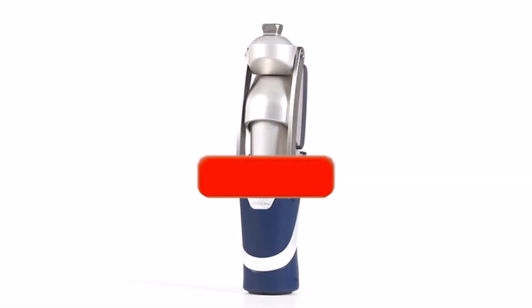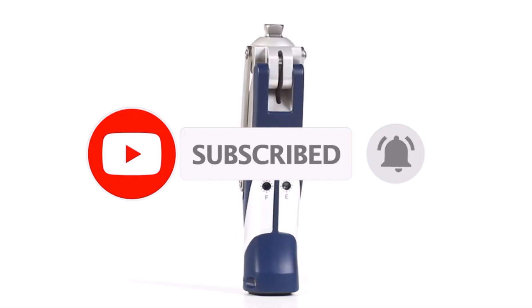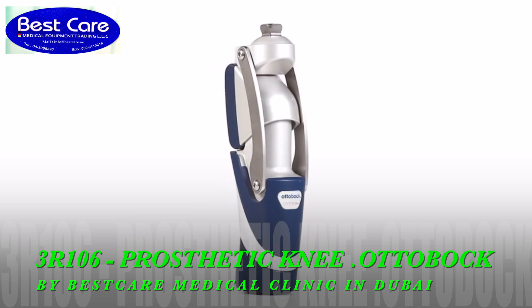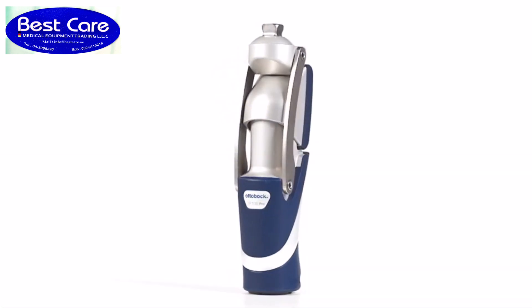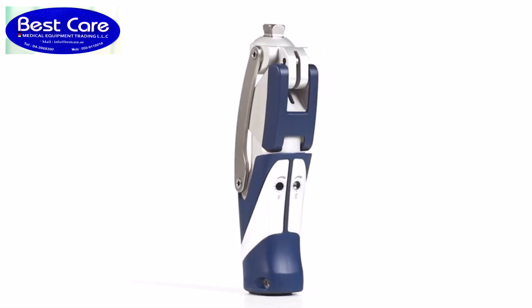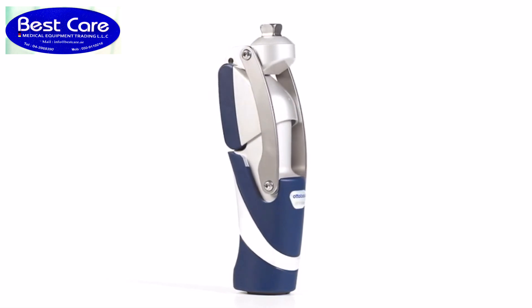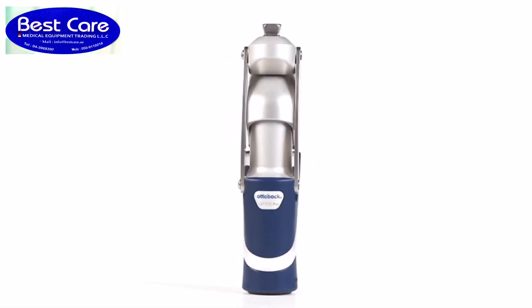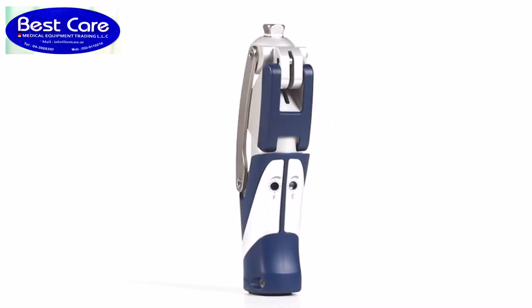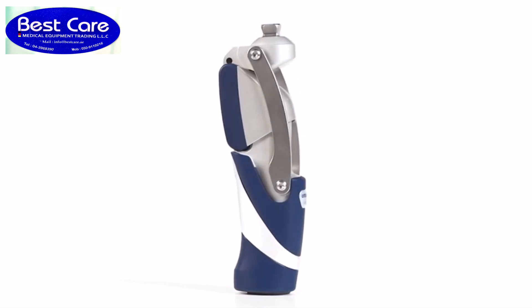The key element of the polycentric prosthetic knee joint 3R 106 Pro is the servo pneumatic control unit, pre-adjusted to normal walking speeds by the O&P professional. The powerful dual-chamber pneumatic unit with progressive damping properties controls heel rise depending on walking speed, leading to a harmonious gait pattern even at a more rapid pace. The 3R 106 Pro is approved for Mobis 2 and 3 users with a maximum body weight of up to 125 kilograms.